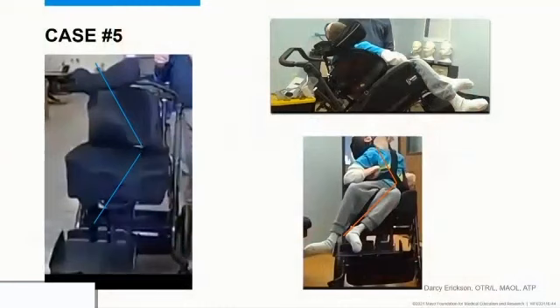This was a different kind of harness that we tried for him because the H harness was in the way. He had a feeding tube still that they would use sometimes, and because of his asymmetrical pull, we got an asymmetrical harness, so he just had loading over one, and it was able to distribute the pressure. So that actually went on the new back, because Mom liked it so much. It was really easy to get in and out, and it helped support him, pulled a little bit away from him turning his head like this all the time, so it helped stabilize him. It made about 1.5 inches difference on where we had to place the headrest compared to when we didn't have it on. So it really did help center his body a little bit.